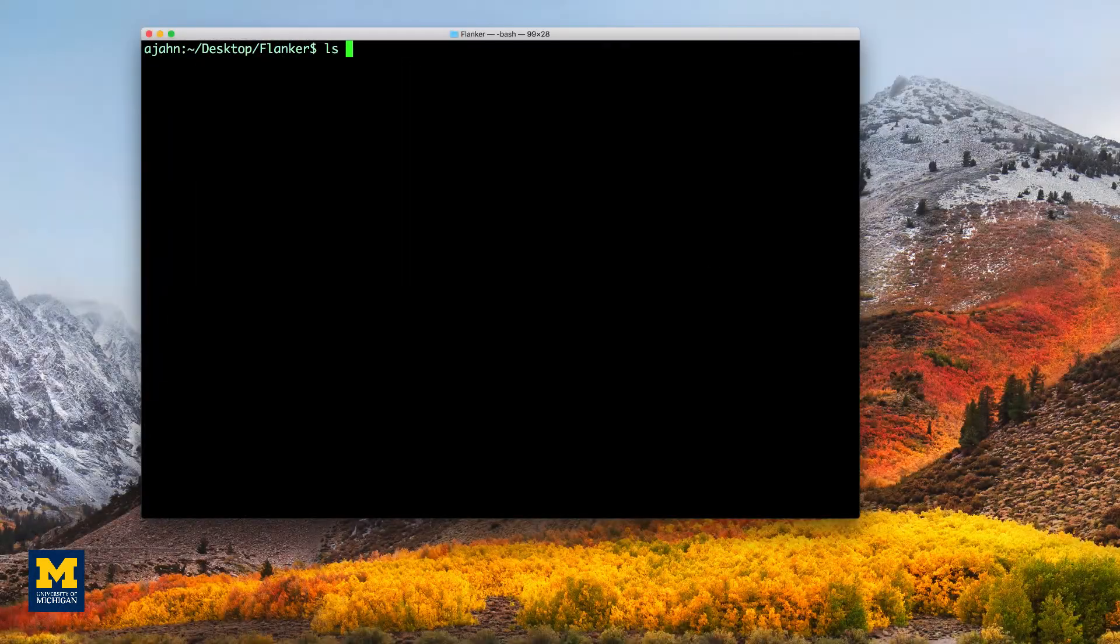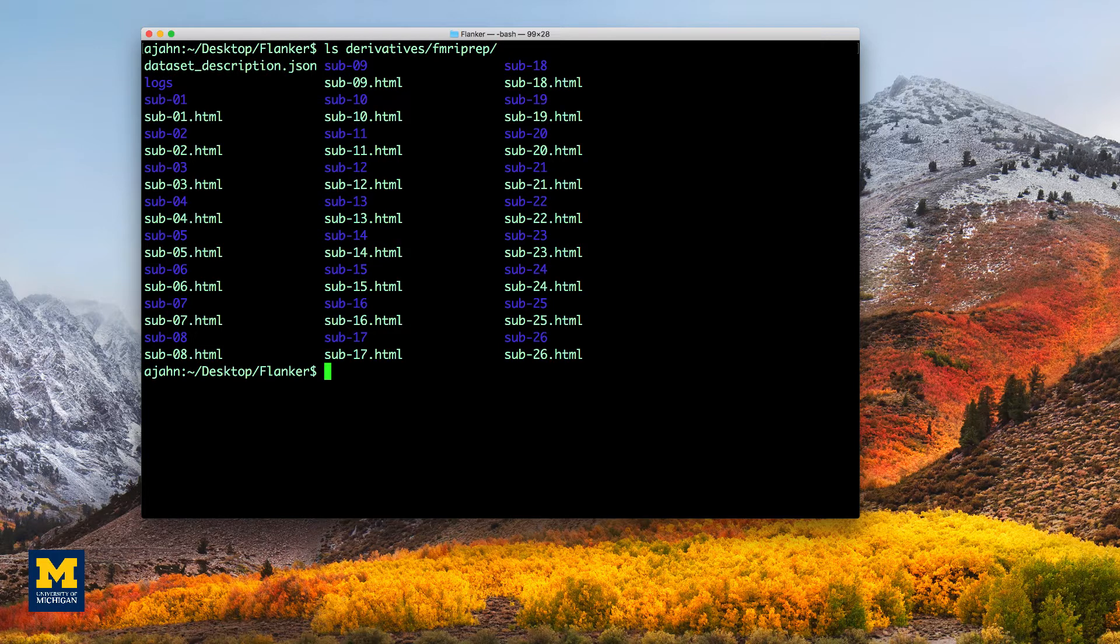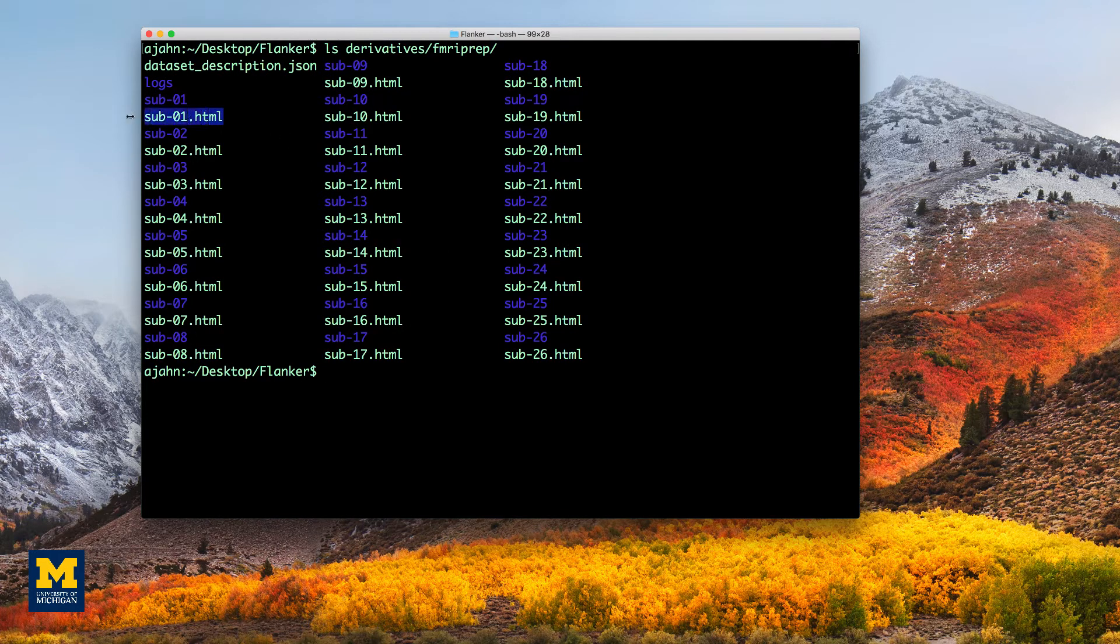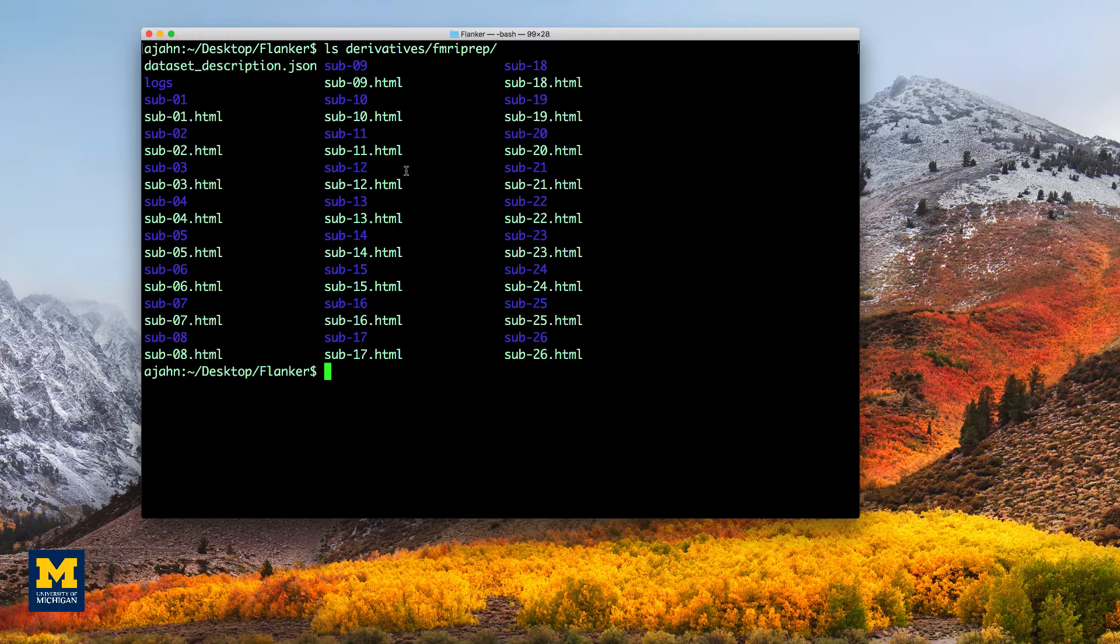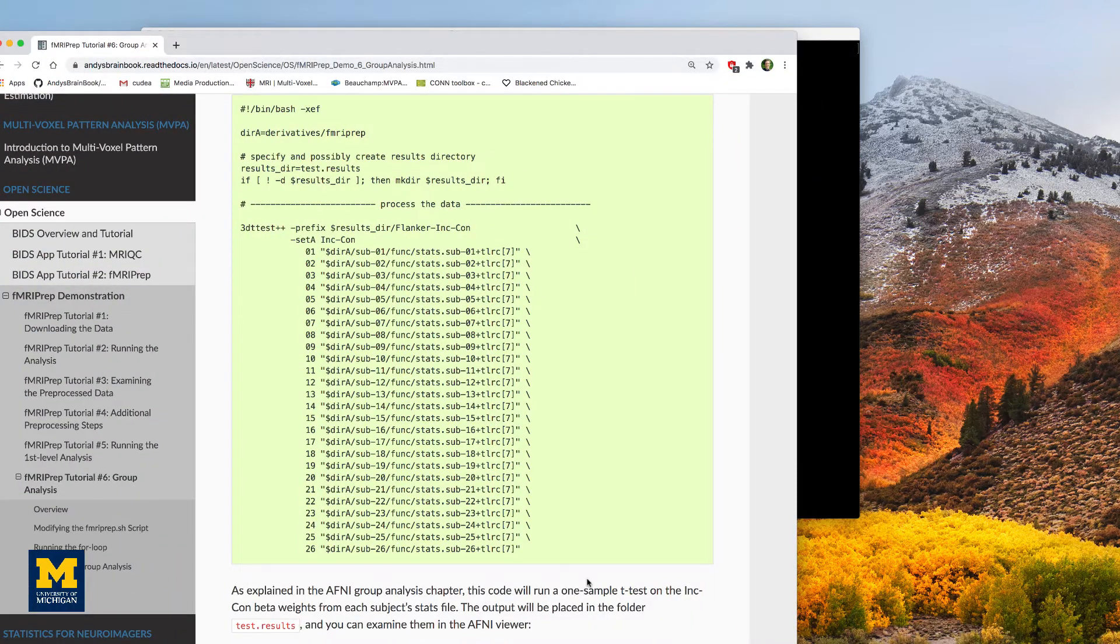When the script is finished, do the same quality assurance checks that we covered in the previous chapters, examining each of these HTML files. If everything looks okay, then we are ready to do a group level analysis using the same approach as in the AFNI tutorial.